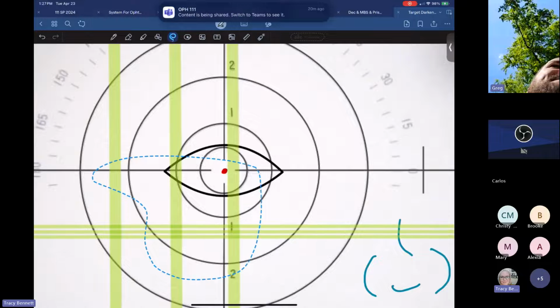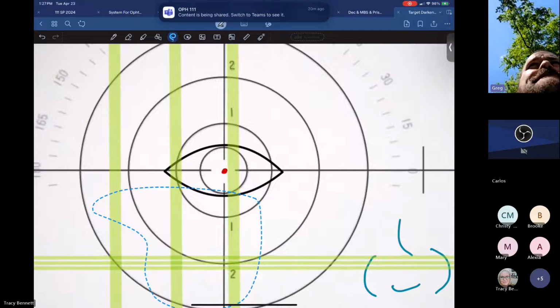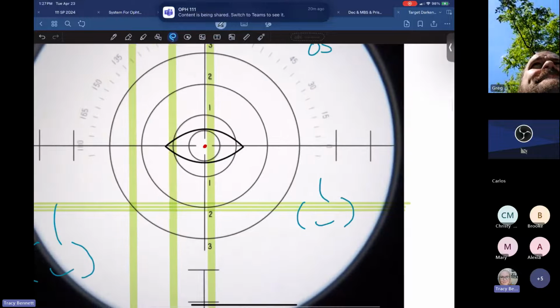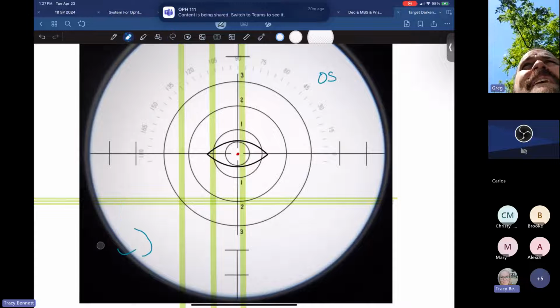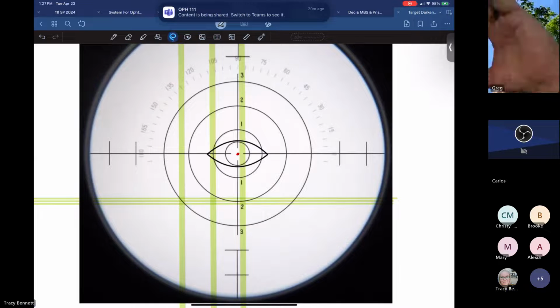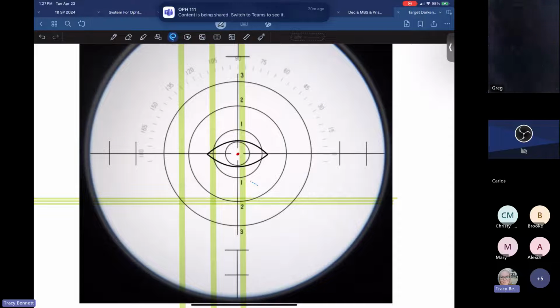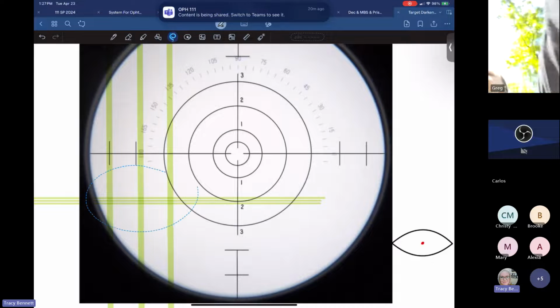Oh, let's go right here. Oh no. So okay, now this is compounding a prism. Before we were dealing with, and does the eye get y'all confused? Because I can take that eye away. It's not on the lensometer anyway. What do you think? Let's take the eye away.